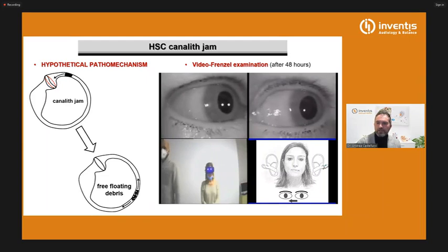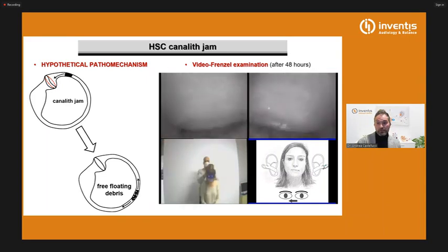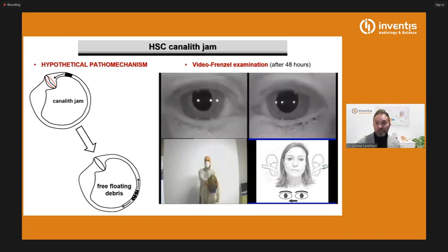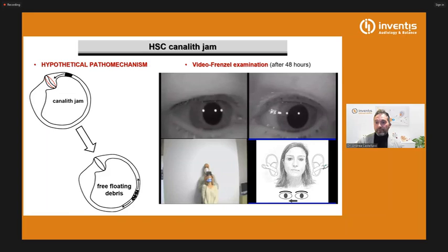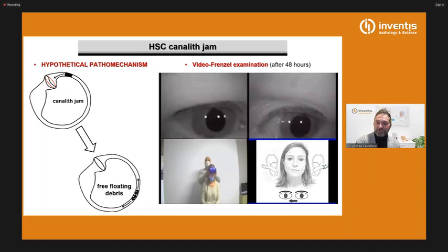And this tiny right beating nystagmus is modulated by gravity. Actually, it is changed by gravity. Now it's a direction change in nystagmus. You can see here how in head pitch test forward, it's right beating, because otoconia are going toward the affected canal, toward the affected side.